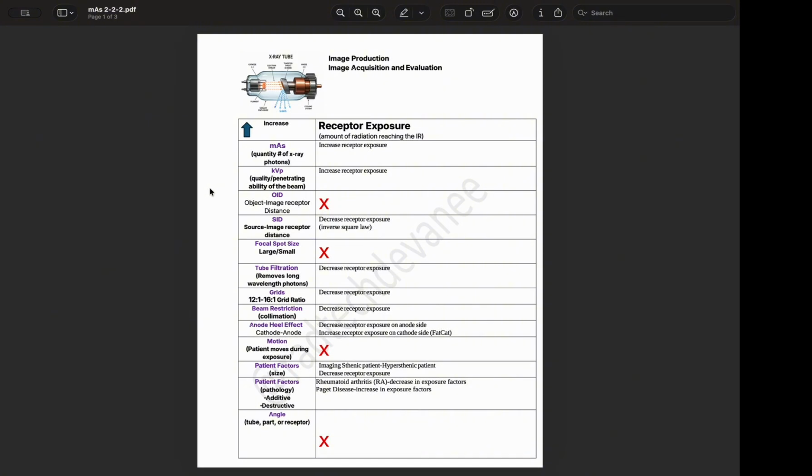I'd like to think of the campfire method. So if I'm close to the campfire, intensity is going to increase, right? Because I'm literally close to the campfire. If I increase my distance, go farther away from the campfire, intensity decreases.